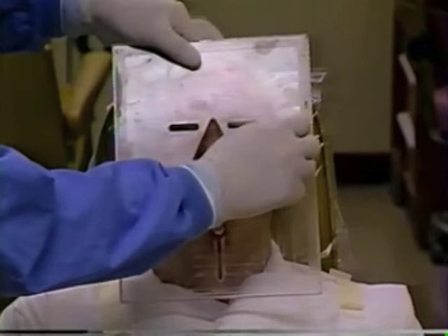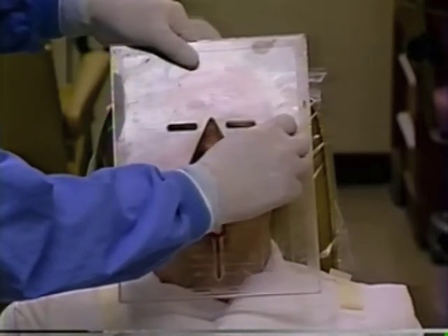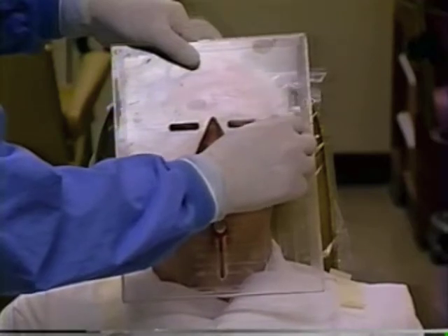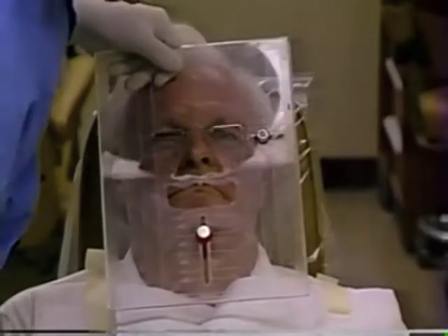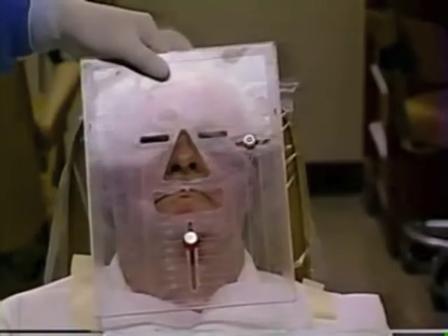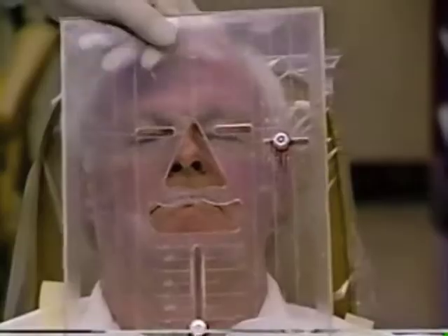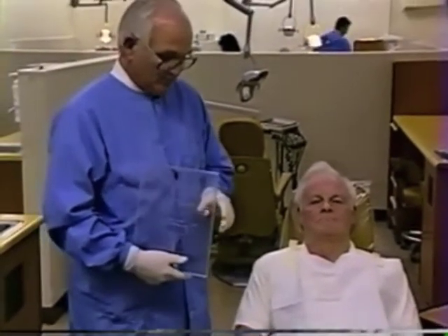We move the side piece in until it touches the zygoma, and we find that gives us roughly seven and three-quarters millimeters in width of a central incisor. So this gadget automatically converts 1/16th the size of the face into the size of a central incisor.